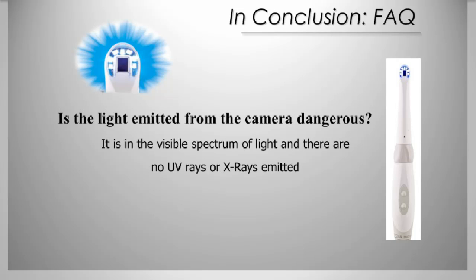I will also add, for my patients, the ones who deny X-rays, I'll say, now I know you didn't want to get X-rays today, so before I get the doctor to come in the room, I know that one area that's bothering you. Let me see if I can put it up on my intraoral camera, which is just like a camcorder, only it goes in your mouth. I do have another setting I can use where it can see if there's any decay, and it will show up in red. There's no extra cost for this, and there's no radiation. Is it okay if I go ahead and get that now?